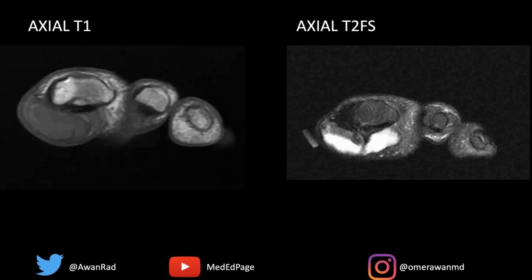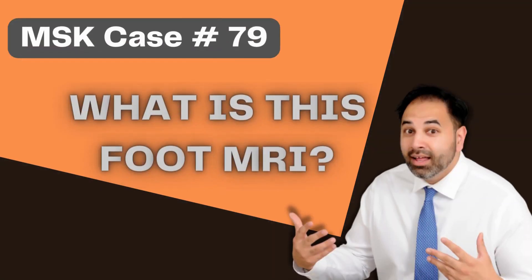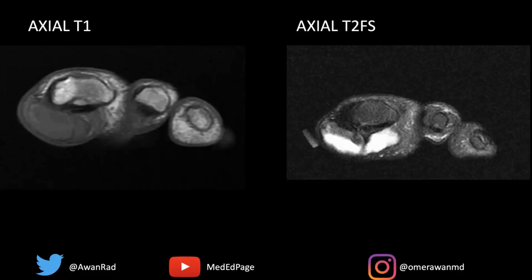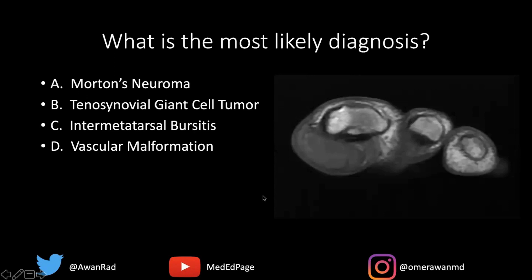Hello everyone, and welcome to MSK case number 79. We have an amazing case here, so let's go ahead and begin. We have an axial T1 and an axial T2 fat-saturated image through the toes. The marker is placed here on the medial aspect of the great toe. The high-yield question is: what's the most likely diagnosis?